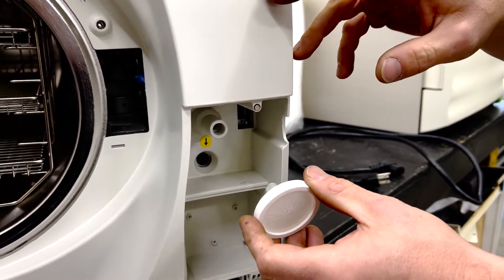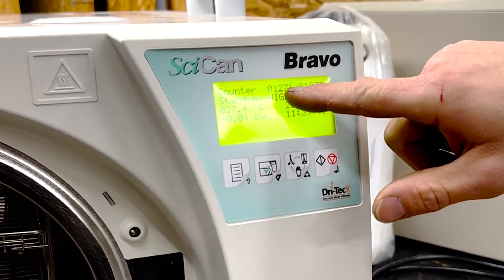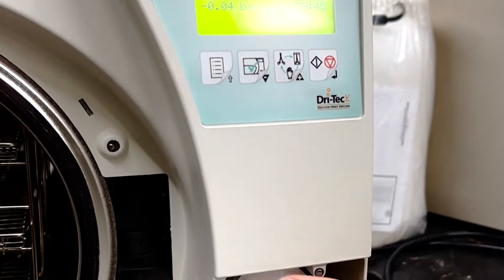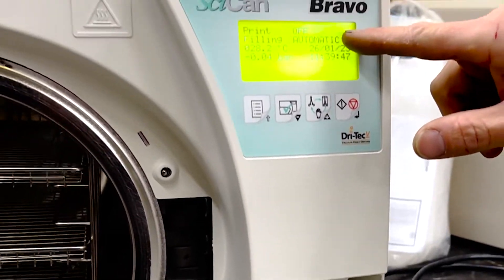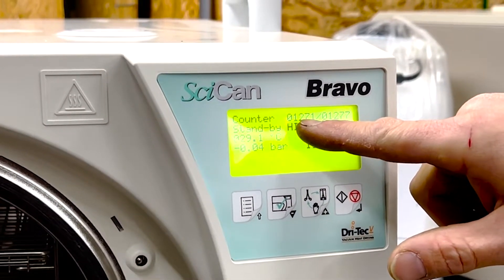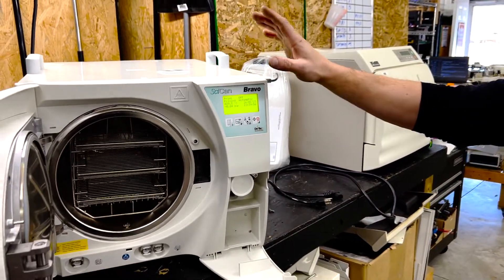Another way to tell how many cycles: there is a cycle counter on here. As you can see, we're at 1,271 slash 1,277. The cycle on the right is how many cycles have been run, and this one is how many cycles have been run successfully. So this unit has had six failures.